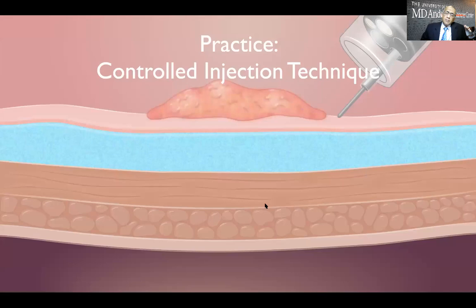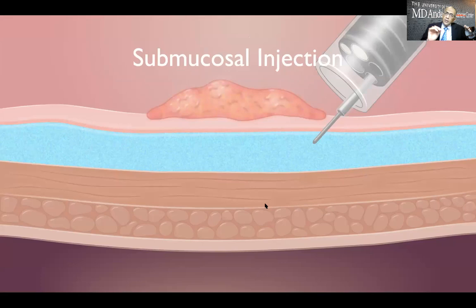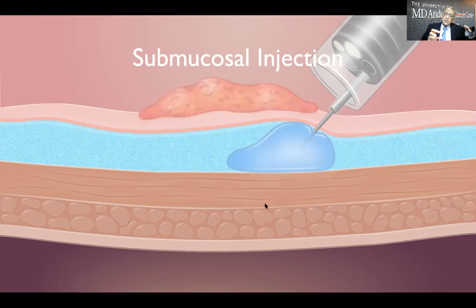So how do we do the plane? What I do is I hold my catheter just one finger to two fingers above my biopsy port, and I make a gentle move. And as I move in, it gets into the submucosa. I don't know whether I got into the submucosa. So the best way to avoid injecting a lot is I ask my assistant to tap, tap, tap, tap on the plunger. That allows a small amount of fluid to come out. And then once you know that there is a small amount of fluid getting into the submucosa, you will see a bleb.